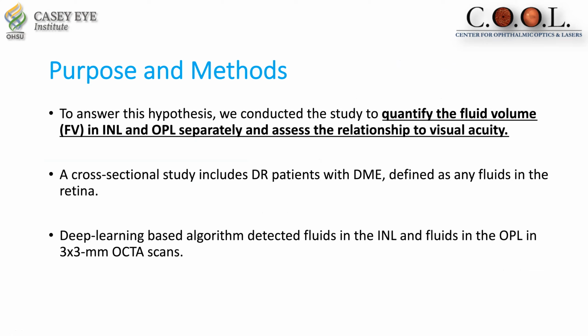To answer this hypothesis, we conducted the study to quantify the fluid volume in INL and OPL separately and assess the relationship to visual acuity.